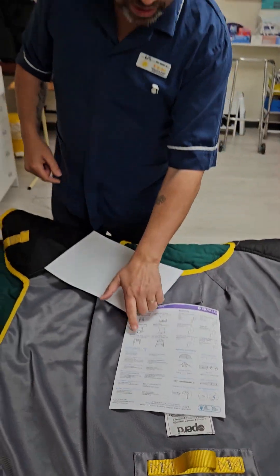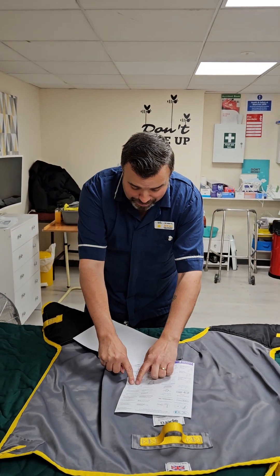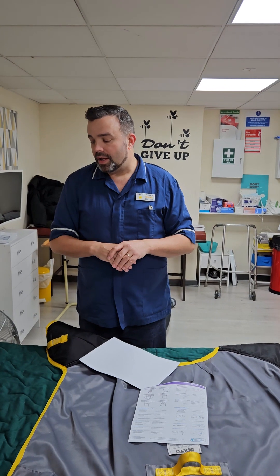We also have toileting slings, which have a much bigger aperture and are used for bed to commode transfers. So that's what you need to know about slings.